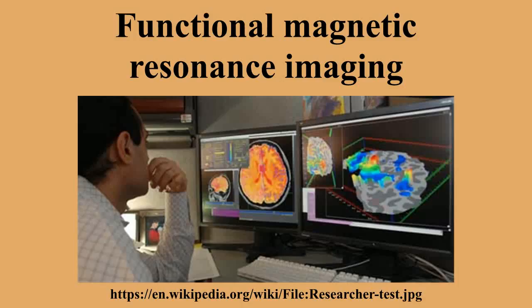Three studies in 1992 were the first to explore using the BOLD contrast in humans. Kenneth Kwong and colleagues used a gradient echo echoplanar imaging sequence at a magnetic field strength of 1.5 T to study activation in the visual cortex. Ogawa and others conducted the study using a higher field and showed that the BOLD signal depended on T2* loss of magnetization.